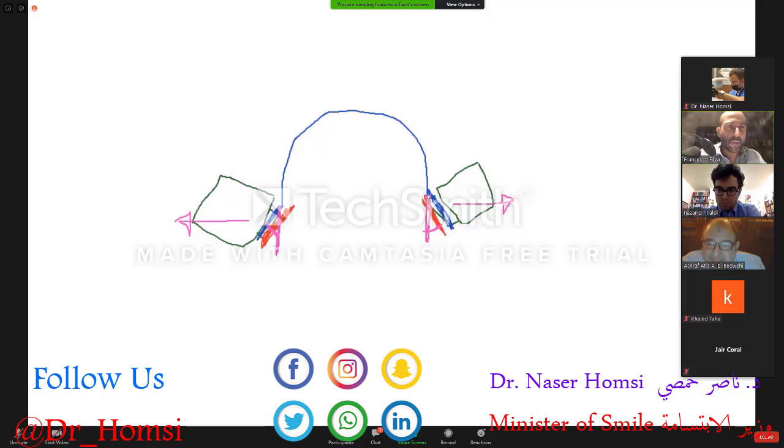It allows us to go into deeper consideration of this case. In this particular case, the tooth was quite proclined, and we were able to reach the center of resistance from a lateral point of view, because the cantilever had an inward bending, and it's not easy to see from this perspective.